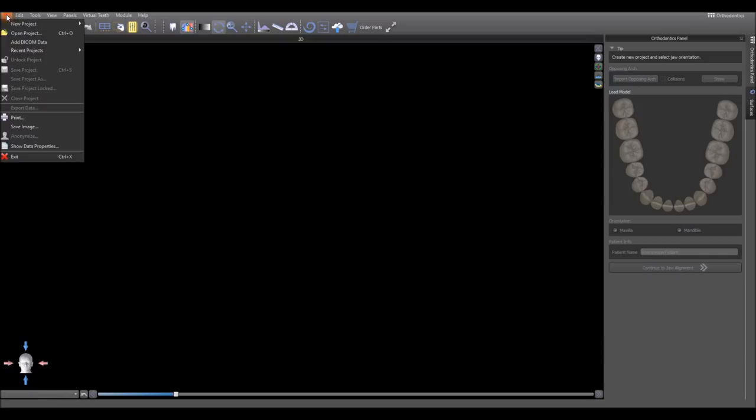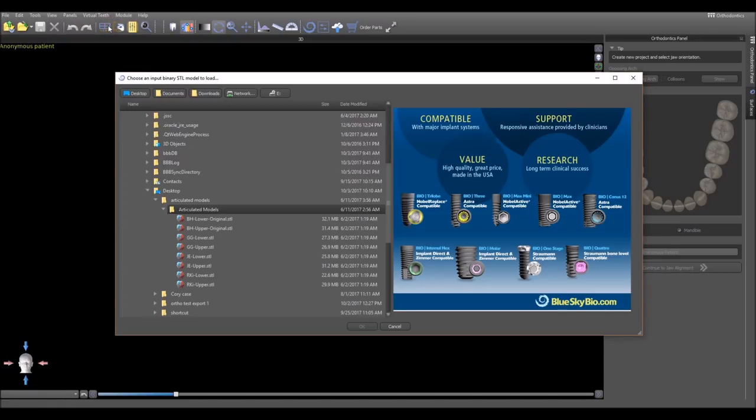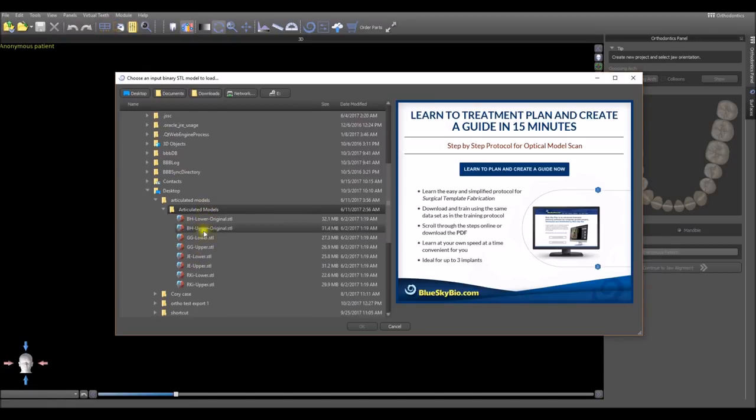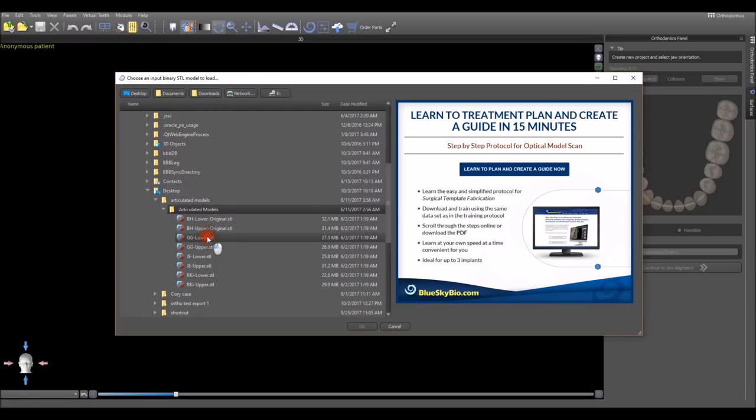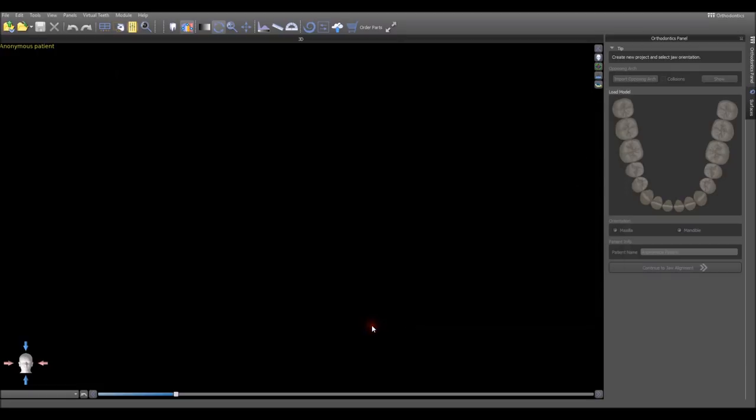Loading a case, you go to File menu, New Project, and select the option to import an STL file. Navigate to the location on your computer for the relevant model. We're going to load the lower model here and press OK.